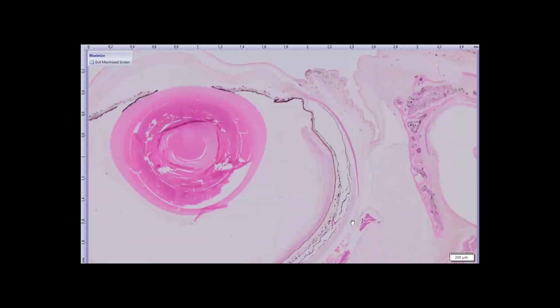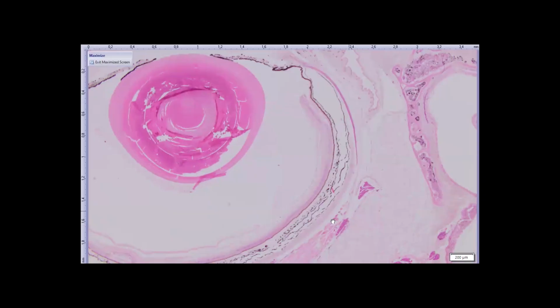Again, this is the decalcified head. Here's the eye. And we'll start right out with the brill or spectacle, if you will. And again, you can see there's a two-layered spectacle here. Now, this is not a snake, so there is an annular pad in the lens. There's a bone in the sclera. There's cartilage in the sclera, just as there should be in a reptile.